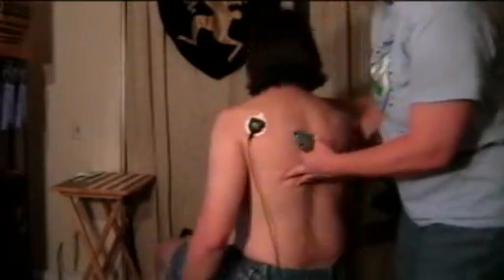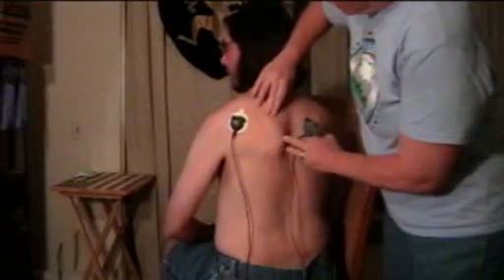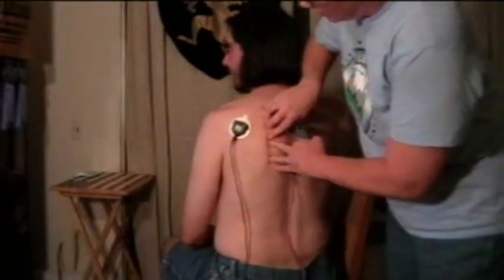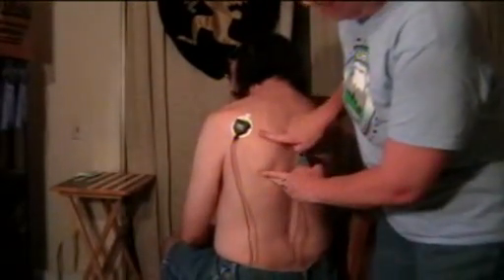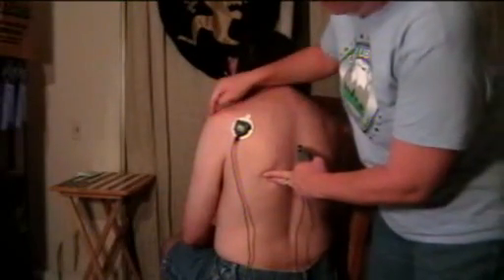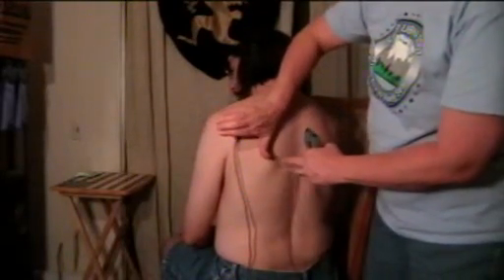Turn completely to the back. What you're going to do is find the shoulder blade. Here's the ridge — he can do bad things with his shoulder blade. Find the ridge of the shoulder blade, which is kind of like this. The bottom of the shoulder blade kind of comes like this, so the shoulder blade is this big triangle that goes out to the point. You're going to want to try and put this electrode on the middle of the triangle, sort of facing from the middle of the edge of this shoulder blade down to here and up to the point of the shoulder. That's going to capture muscles that are on the back of the shoulder blade, and pull the arm around like that.